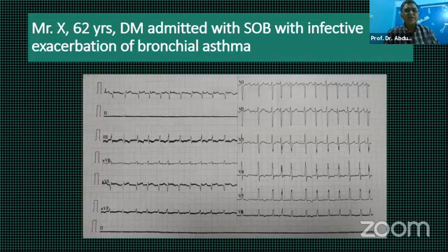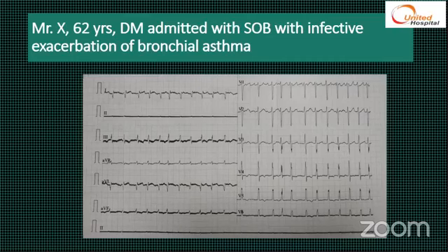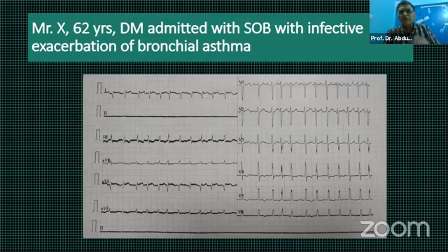That's one thing. Second is, before calling AF, look at V1. We are getting a P wave like structure in there. Is it a P wave or is it atrial tachycardia? That's a possibility. Right, sir. It may be, sir, atrial tachycardia, or atrial flutter with variable conduction may be a possibility, I think, sir. Limb lead switchover, and also this is not a sinus rhythm.